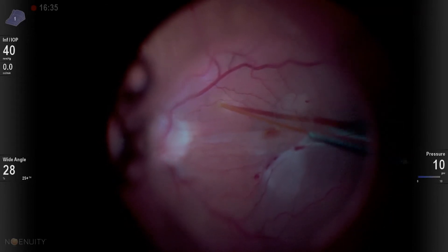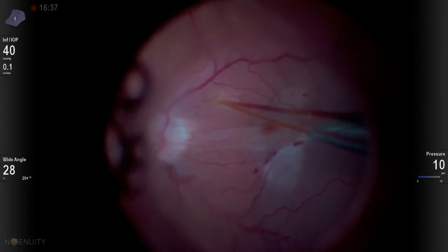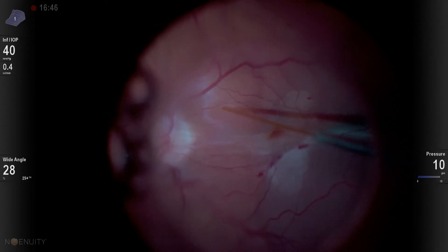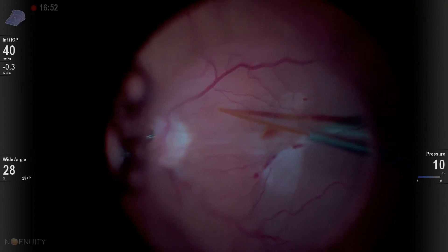I decide let's go nasal. So I go infernasal here, and I get a bubble, and once again it does not dissect into the macula. Instead, it starts to head out into the periphery.